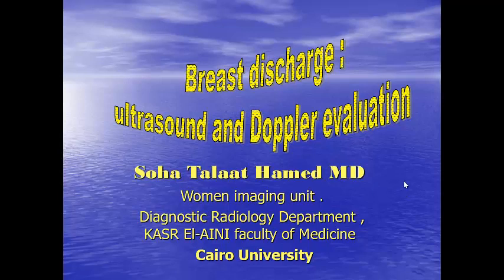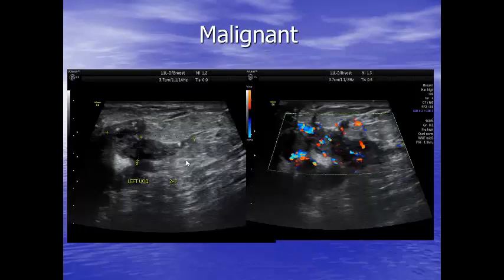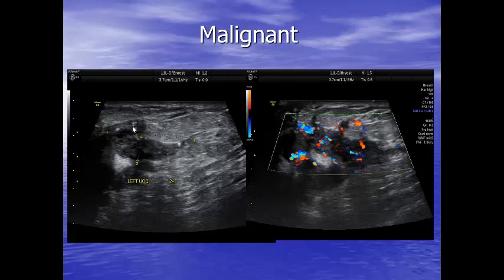Here we have a dilated duct, and this duct contains a hypoechoic lesion with multiple calcifications. On vascularity assessment, there is marked increased vascularity lacking arborization — this is malignant vascularity. There is also extension outside the duct, confirming its malignant nature.